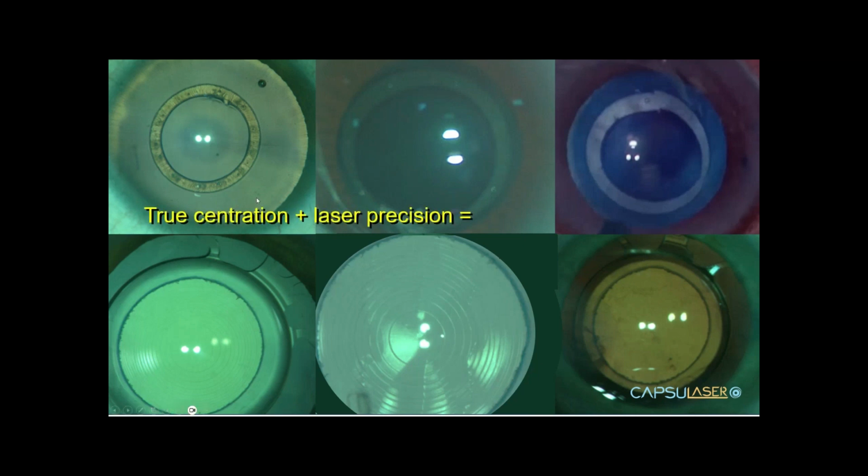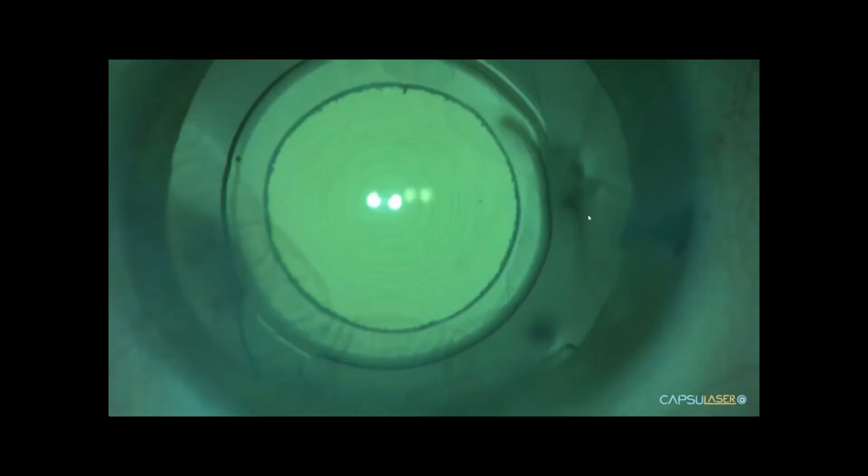This is enabled by using true centration, i.e. Purkinje images, or the Trypan landmark with laser precision, gives you a centered IOL coverage with the capsulotomy for long-term visual acuities. Thank you for your attention.